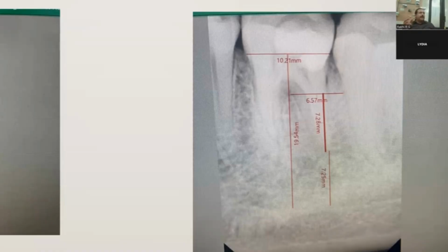So the 3.3 into 11 has to be fitted here, closer to the nearby component of the same tooth, sparing as much as you can between the distal tooth and this implant, so that you will never hamper the interradicular bone of 7 and 6. And you have to connect the 6 to the 6, both components of the 6. Reason, there is no interdental bone much to spare. So you have to connect it.